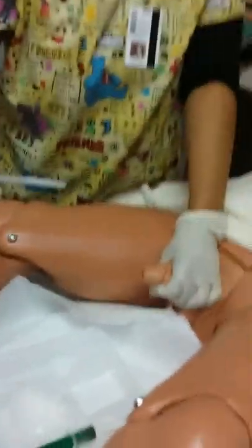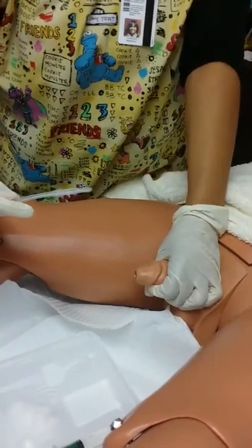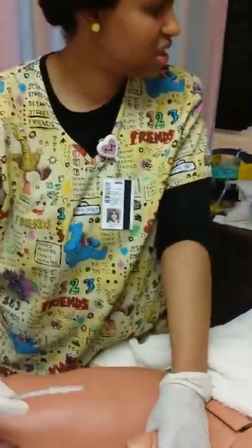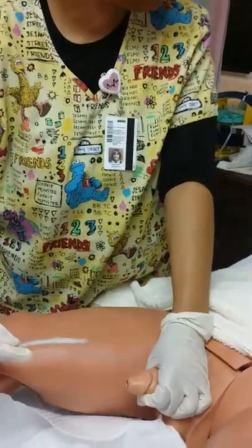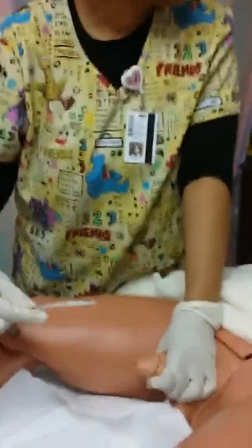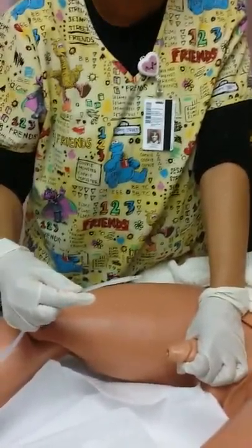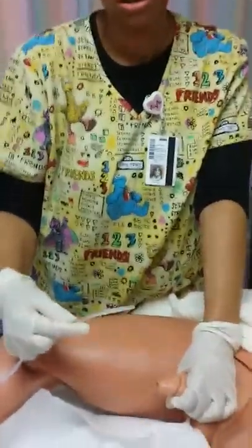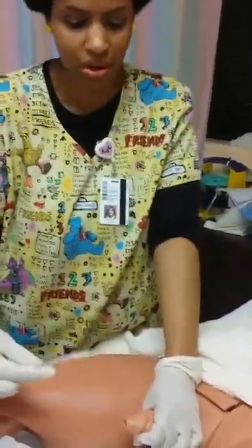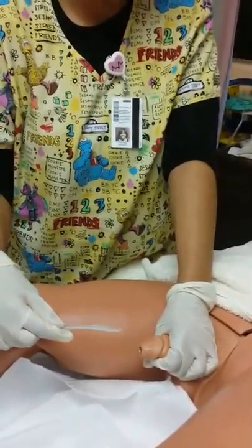So I'm going to prepare my patient, okay? So I'm going to go ahead and insert this catheter. Like I stated before, you're going to have some burning. You might feel a little uncomfortable, but I'll try to do this as easy and make it as comfortable for you as possible. You can have the patient bear down to make it go smoother, but I also looked at a video and it said wiggle your toes. That causes you to bear down as well. So either one works. Go ahead and bear down or wiggle your toes, whichever you want to do.